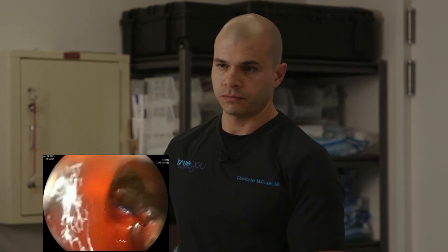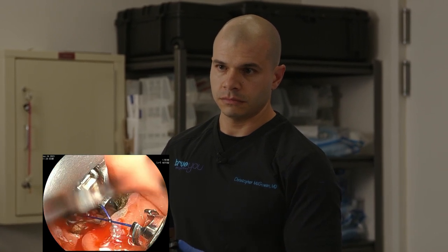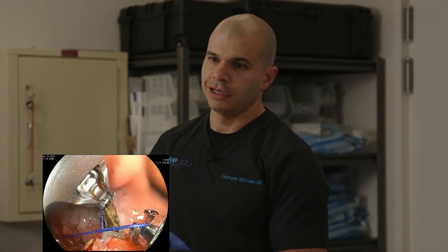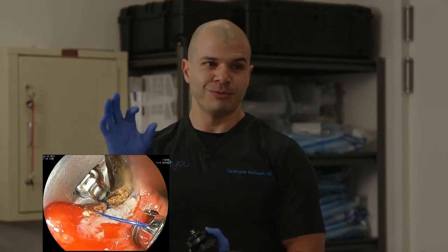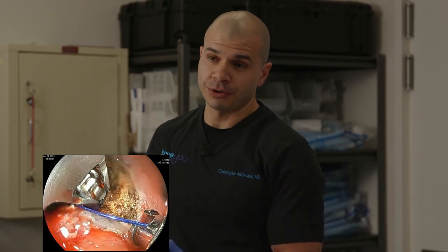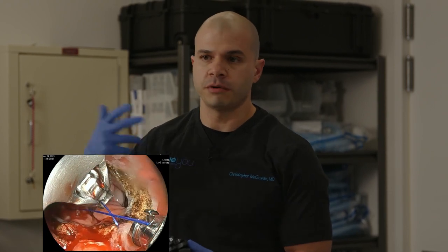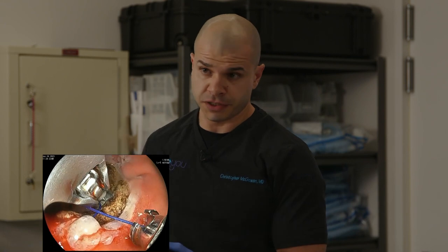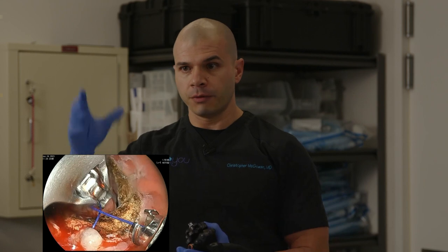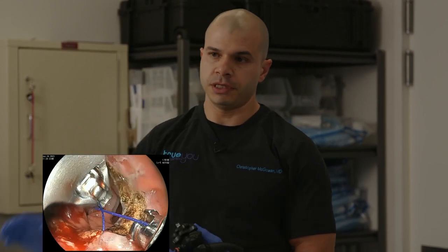I'll do that. The next technical question is from Pierre on LinkedIn. The gastrojejunal anastomosis can be lateral or terminolateral, which allows for easier endoscopic revision. Yeah, the easiest revision, and by the way, every pouch is different, all anatomy is different. That's one of the components of this procedure that makes it so interesting for us. Every patient's different. We really have to improvise at times. We really have to address the specific situation. But the best pouch, the best anatomy is a larger pouch with a directly in-line outlet, straight ahead. I mean, that's going to be the easiest always.